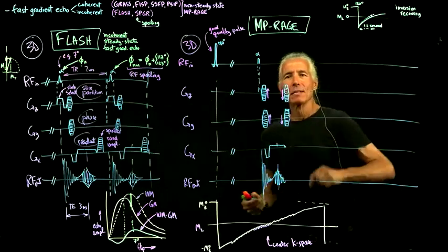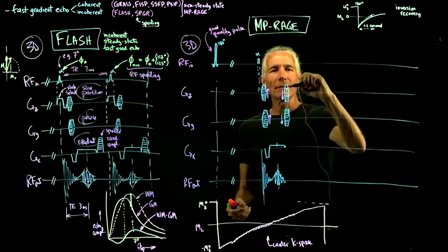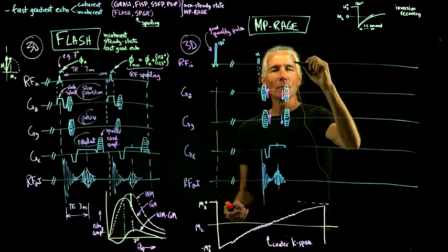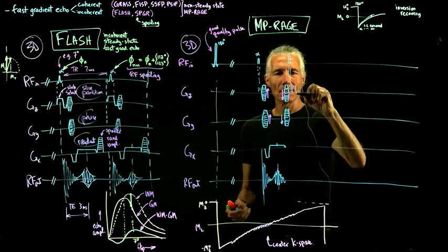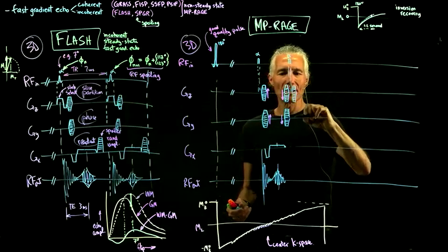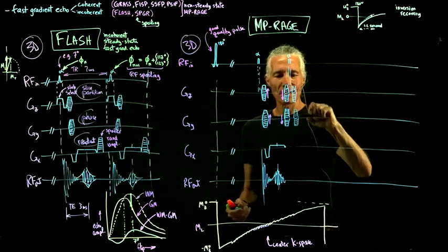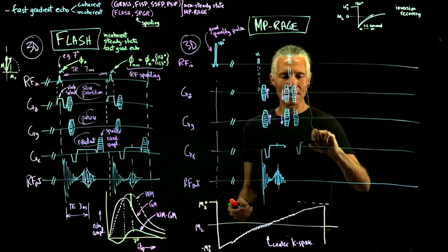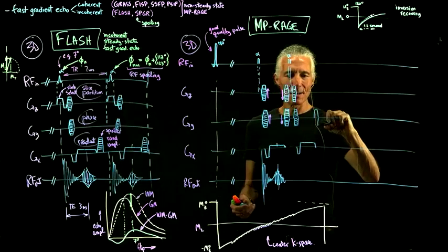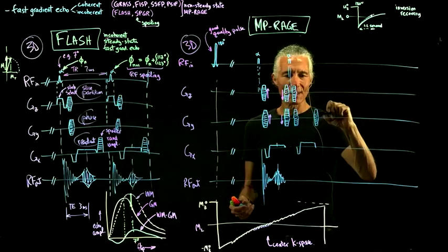And so now we're ready to do another alpha pulse. And so just do the same thing again. Pick another partition direction. Pick another combination of phase encode. Go to the left side of K-space. Record another one. And then when you're done, fix again.